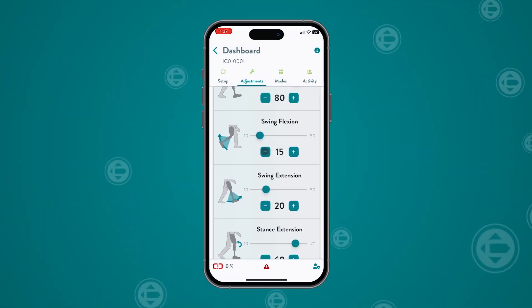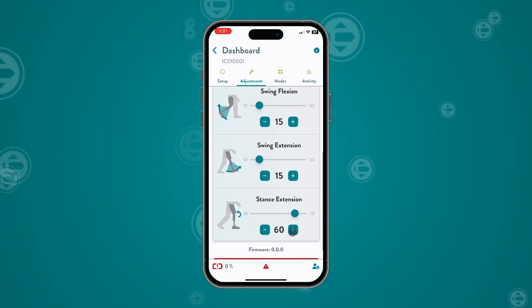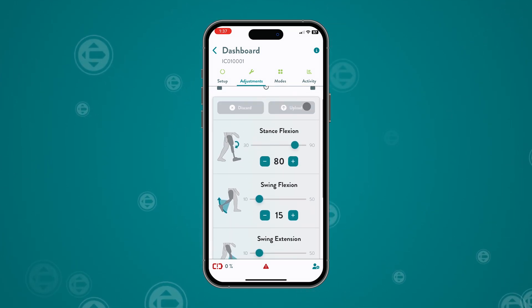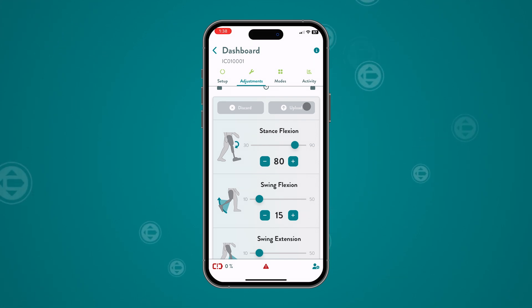Continue by adjusting the swing flexion, the swing extension, and finally the stance extension resistance. When you are satisfied with the adjustments, tap Upload to save changes to the knee. An alert tone will play to confirm the change.